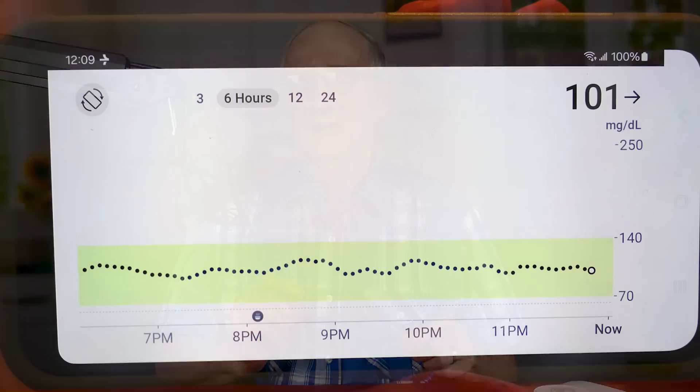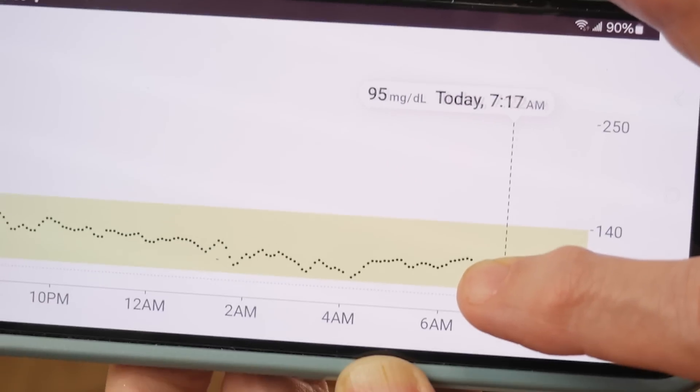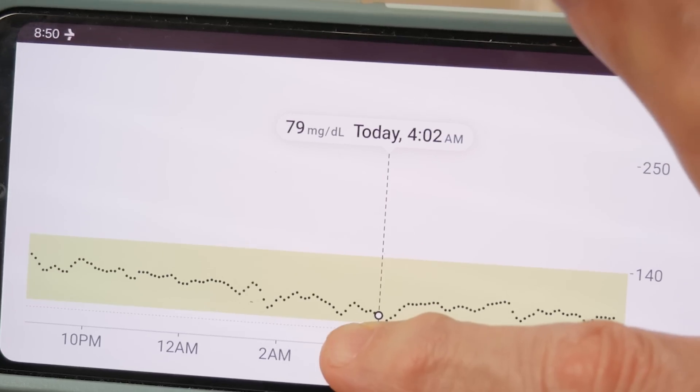Another thing I didn't think I'd care for was that the glucose record of your day shows as a bunch of little dots rather than numbers. But then I realized you can run your finger across those dots and it will give you numbers above them, so you can see exactly what the numbers are. So I was like, okay, I think that will work for me.